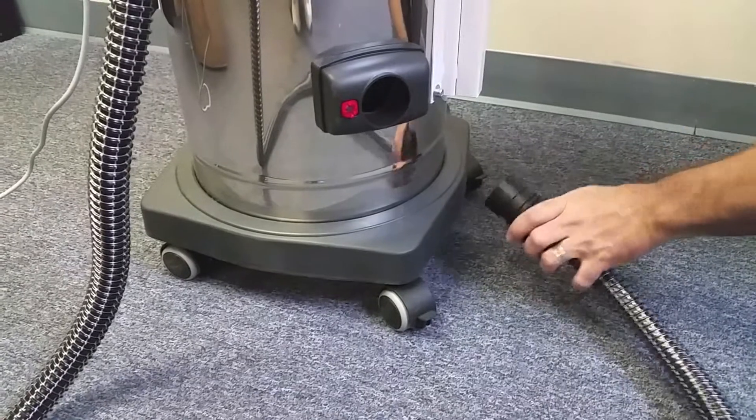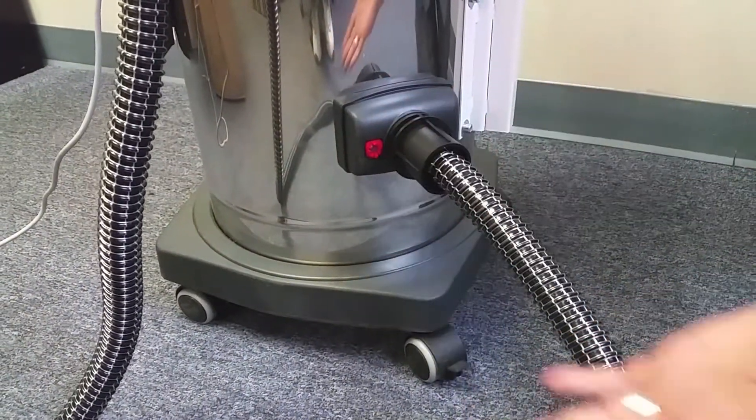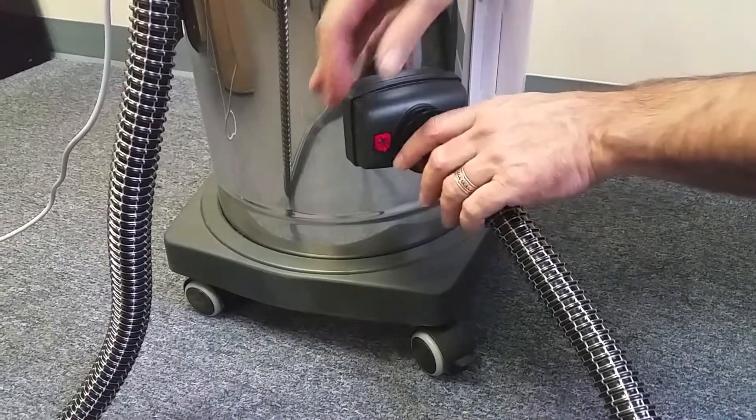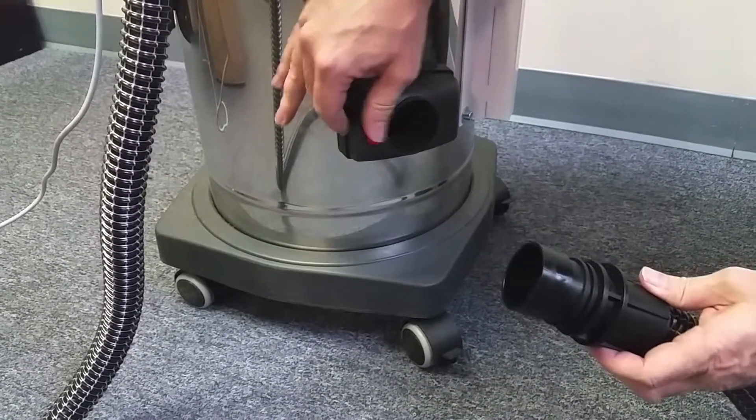The other end of the vacuum hose seats in the canister's vacuum inlet with very little pressure. To remove the hose, slide the red switch away from the hose while pulling the hose away from the canister.